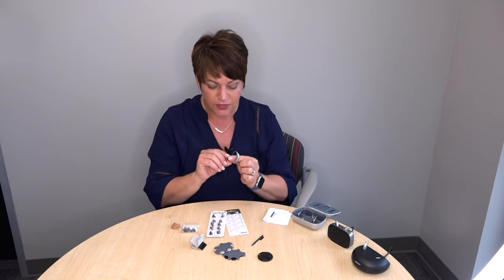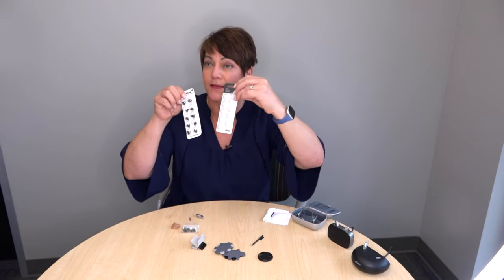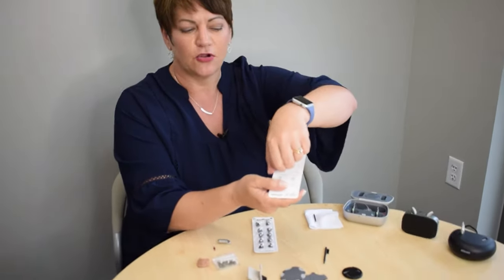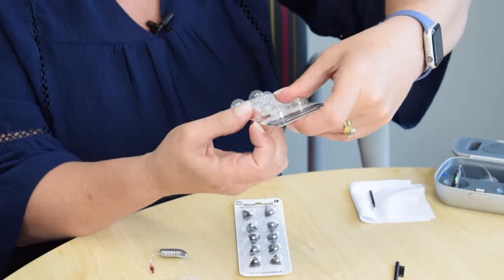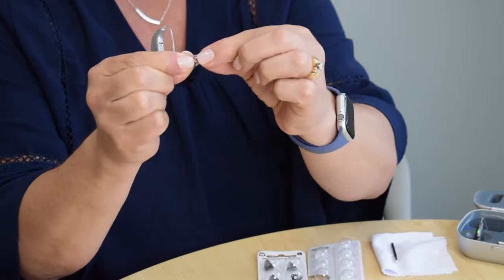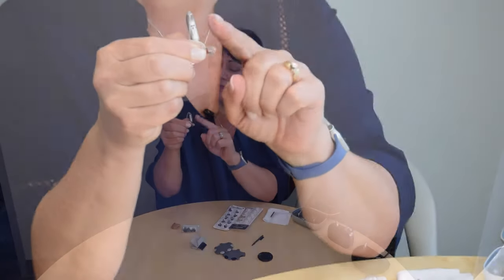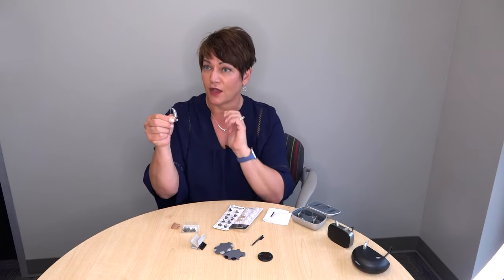Now that the filter is replaced, we're going to put the dome back on. Domes come in little packages — they might be black, gray, or white depending on the manufacturer. Flip your package over, open the little tab, and grab one of the domes. My best recommendation is to simply take your receiver and your dome and push them straight together — no twisting or turning. Give it a little tug to make sure it's fully on. That's how you place your dome back on, and it pulls off and pushes back on exactly the same way.